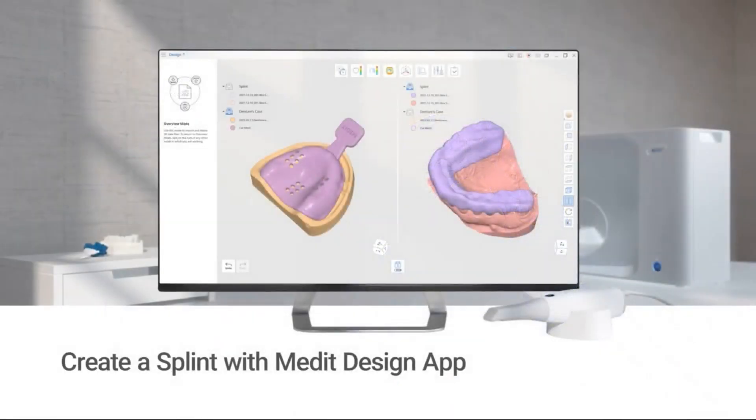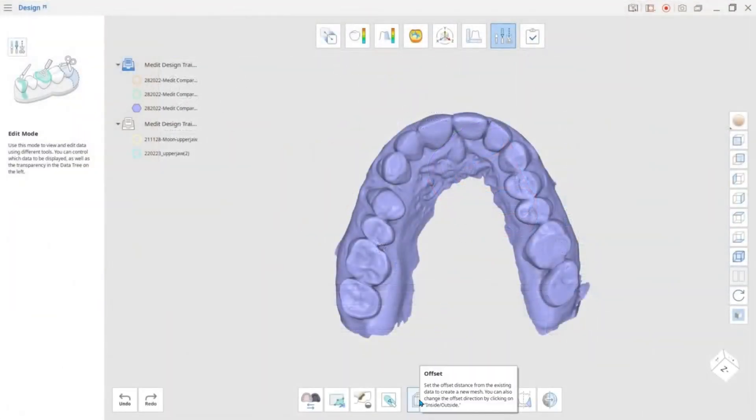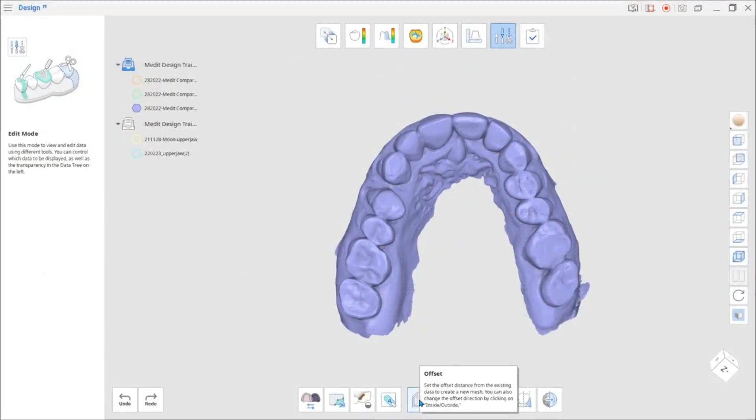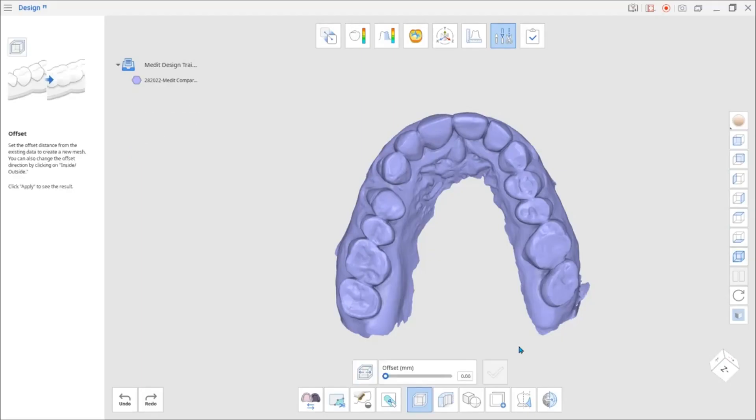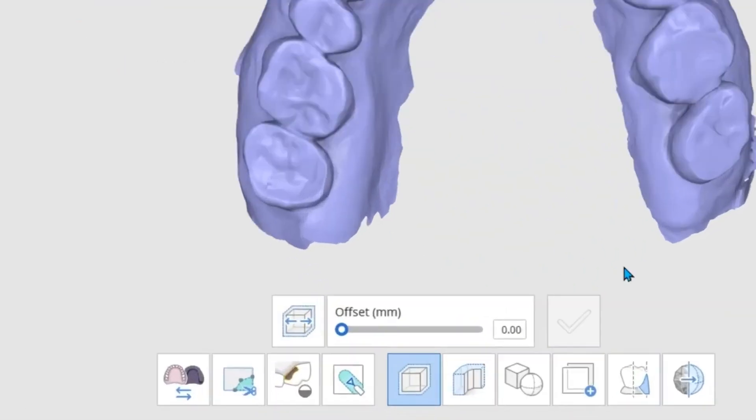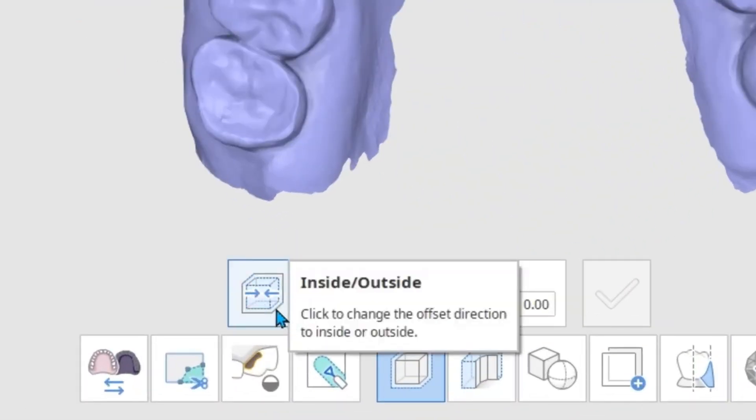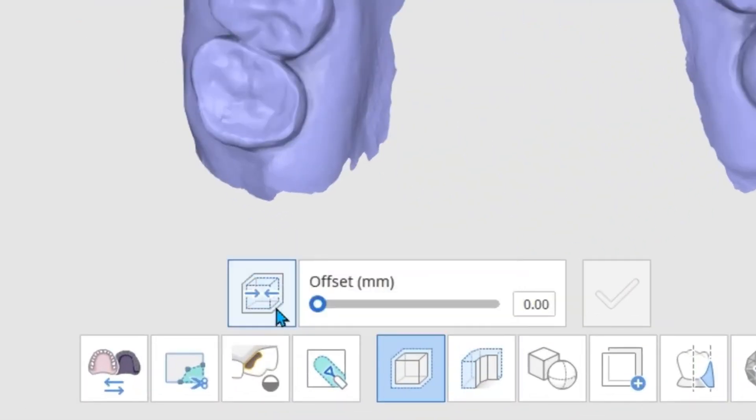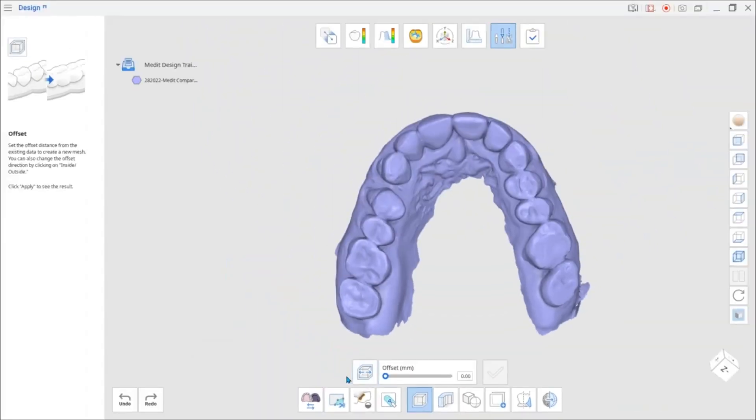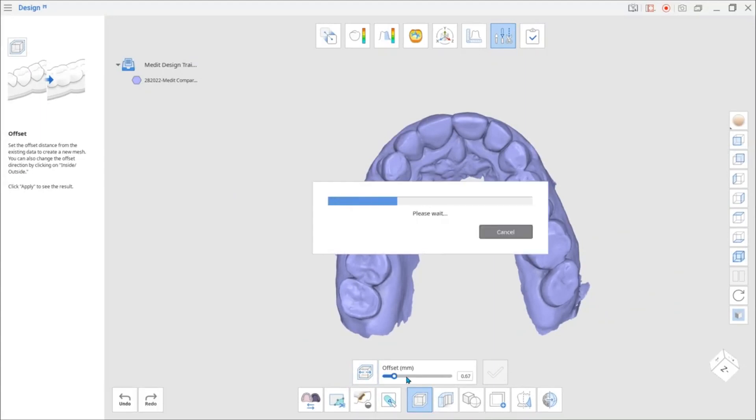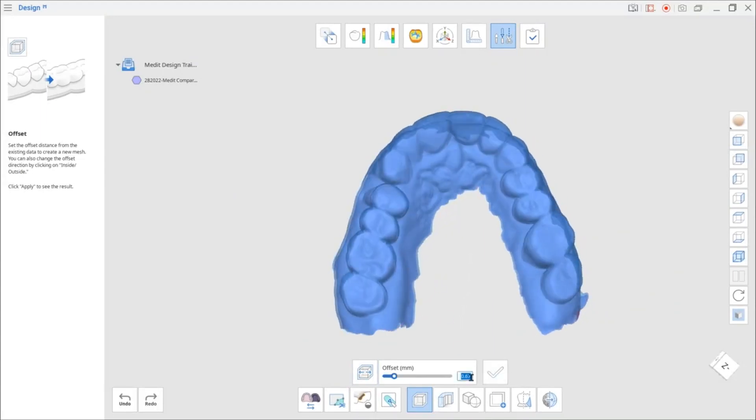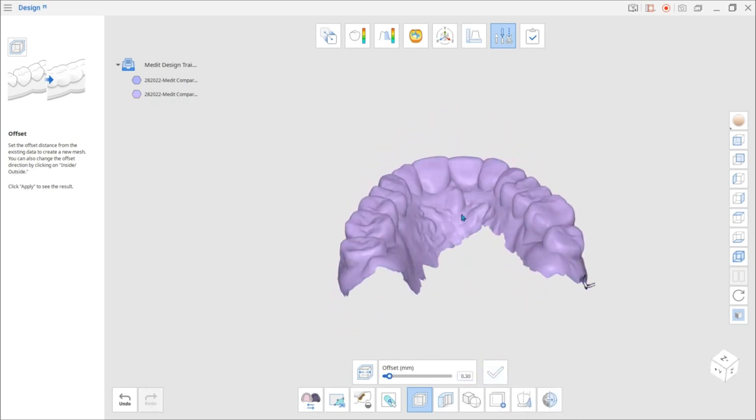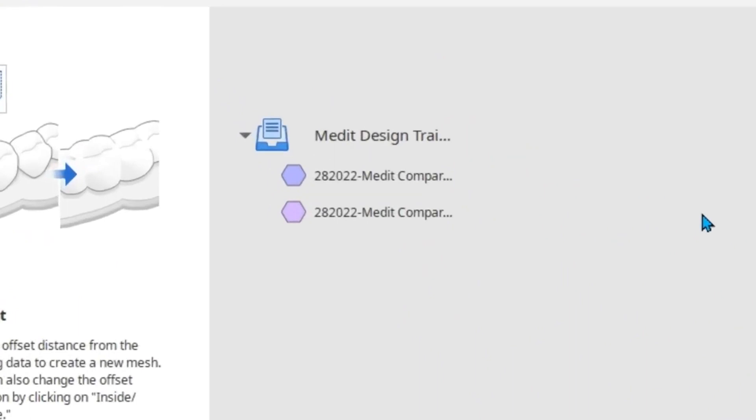One of the new features is the Offset that allows you to create an offset. You can change offset direction to either inside or outside. To do this, click on the inside-outside icon next to the slider. New data will appear in the data tree.